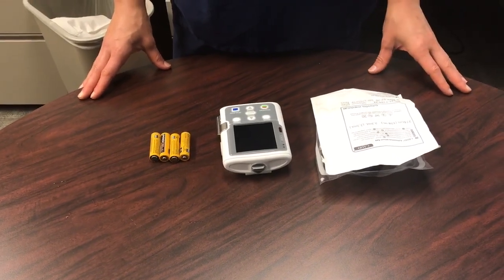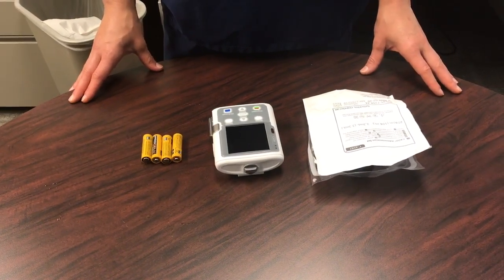Hello! Today we're going to be going over how to set up the CADD-Solis pump.